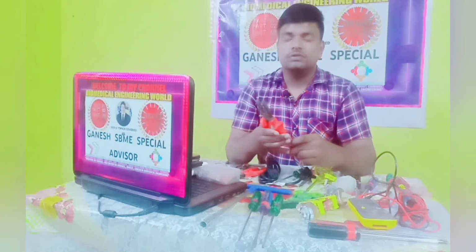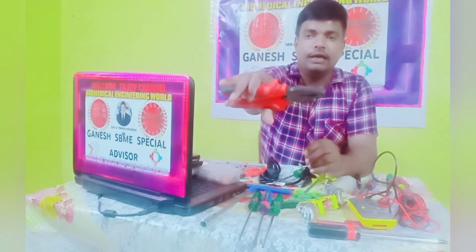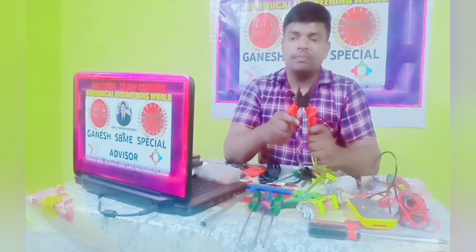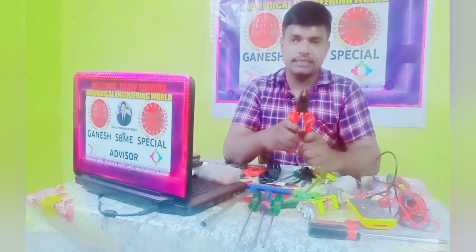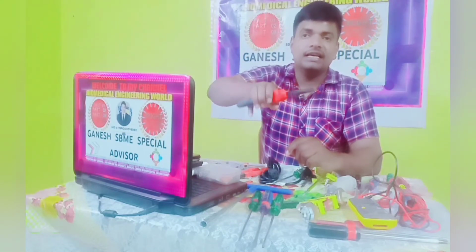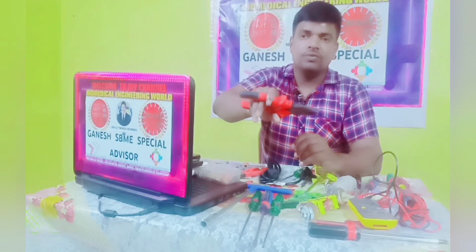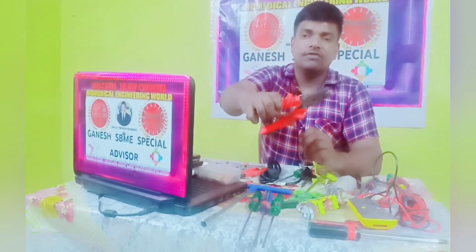Next one, this one, cutting plier. It can be used whenever wires need cutting, lengthy wires, and sometimes for a few components that cannot be removed otherwise. By using this we can open, remove and fix parts relevant to medical equipment. It helps to open internal parts and panels of medical devices. It is mostly used in major equipment and sometimes in small minor equipment too, depending on the application. By using this cutting plier we can do many things for servicing medical equipment.